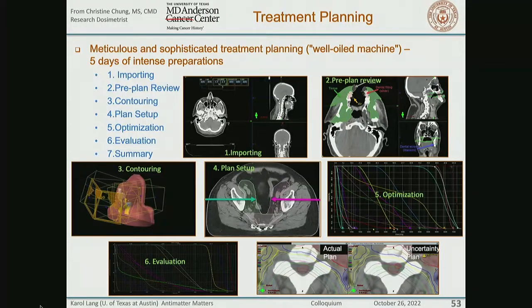It starts on Monday morning, so there's a team of people who take earlier imaging from all 3 devices that I showed you before, from CT scan, from MRI, from PET. They introduce it as an input into simulations, and they design these beamlets one by one.